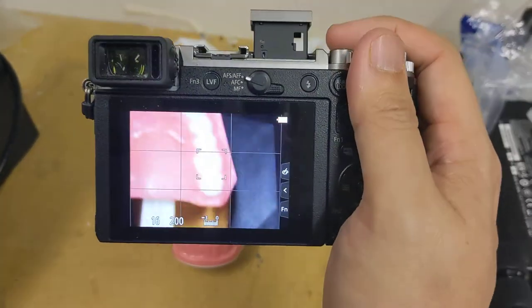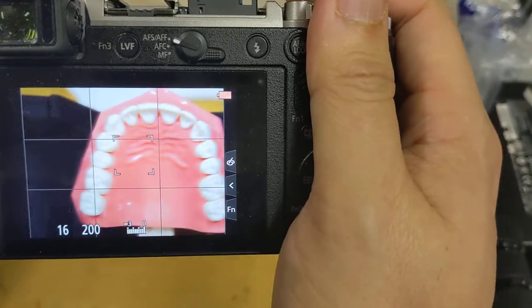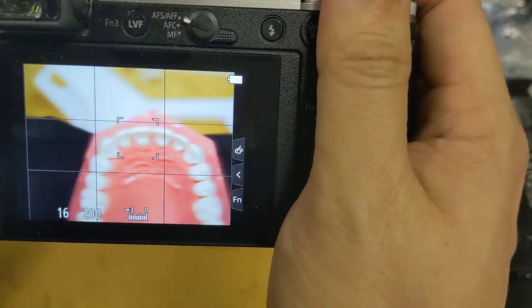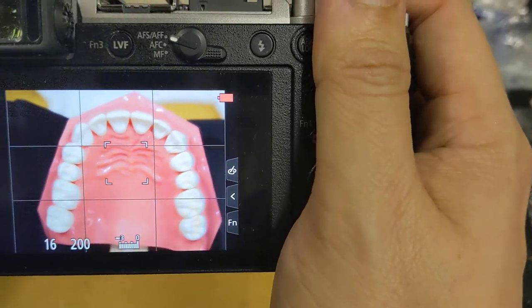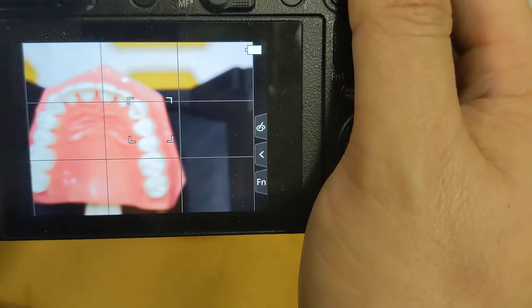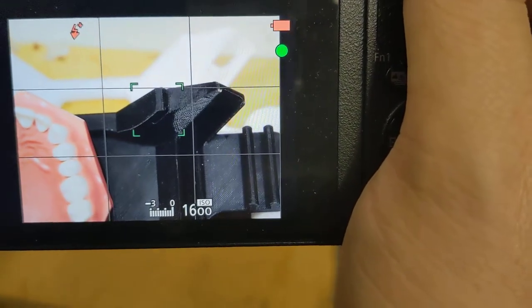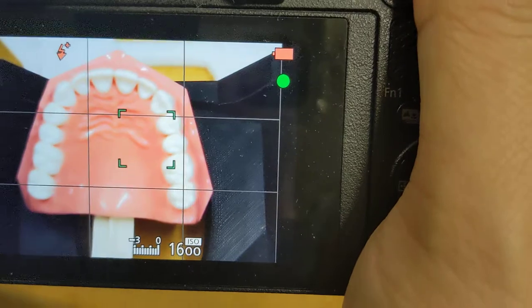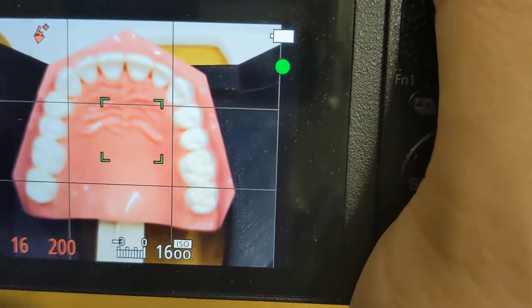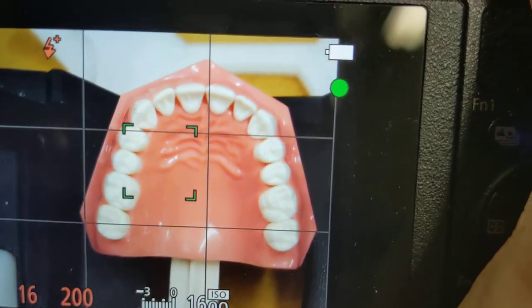One last thing besides focus and recompose: let's say you have a patient's mouth that's just a little dim and just won't focus. Focus on something outside with a sharp edge, such as the patient's lip or even the edge of your retractor. Back up the camera a little bit, focus on that more forward surface, then come back to the tooth and move your camera in and out until it's in sharp focus. Basically we're manually focusing, then shoot, and you'll get your picture that way.